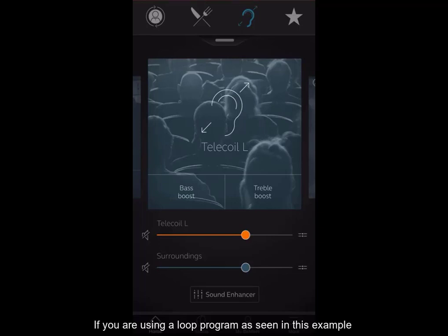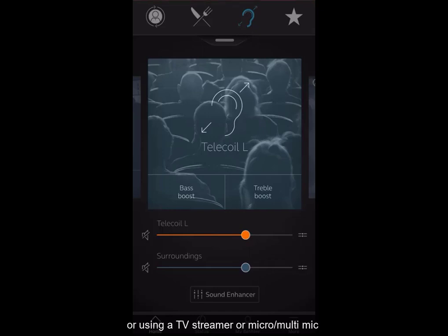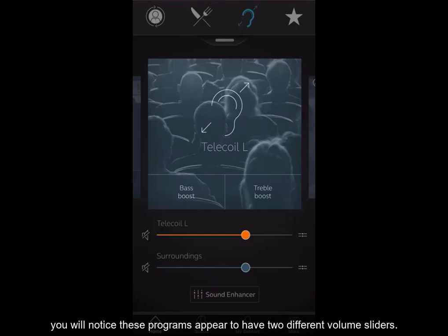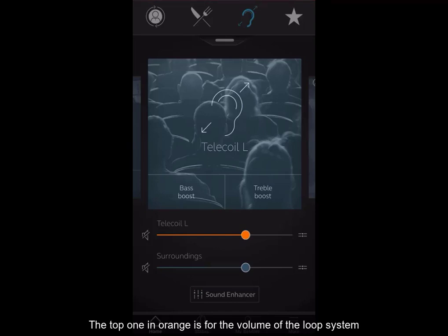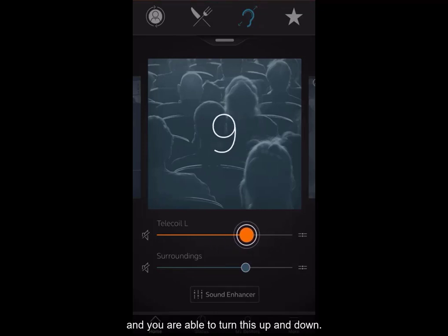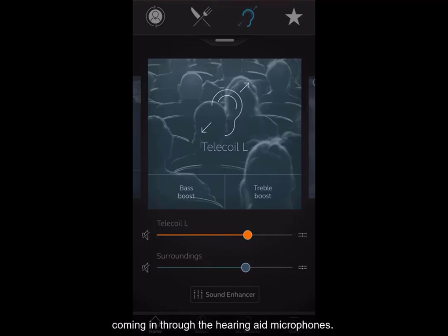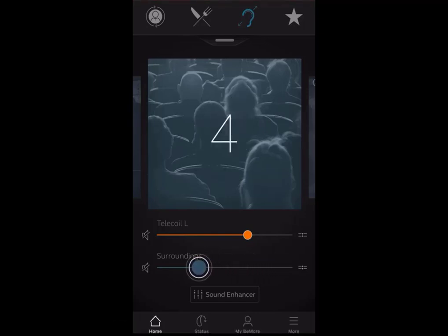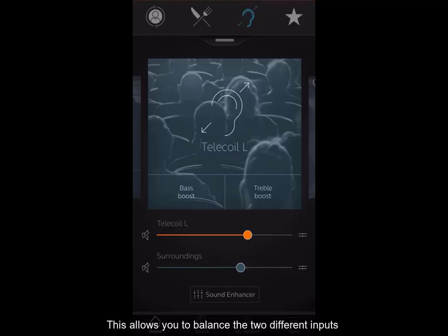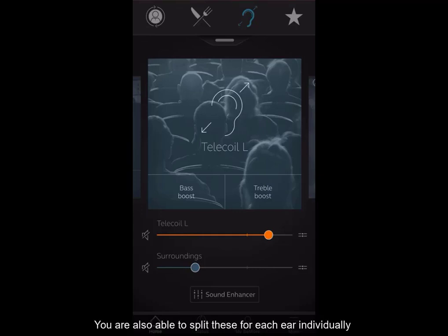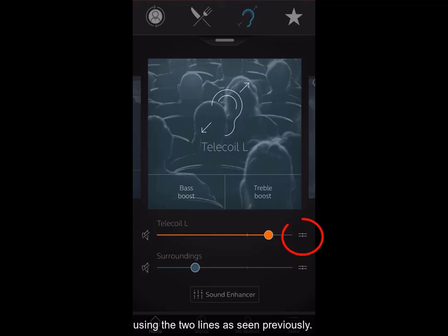If you are using a loop program or using a TV streamer or micro or multi mic, you will notice these programs appear to have two different volume sliders. The top one in orange is for the volume of the loop system, and you are able to turn this up and down. The bottom one in blue is for the volume of the sound coming in through the hearing aid microphones. This will allow you to balance the two different inputs to your personal preference. You are also able to split these for each ear individually using the two lines as seen previously.